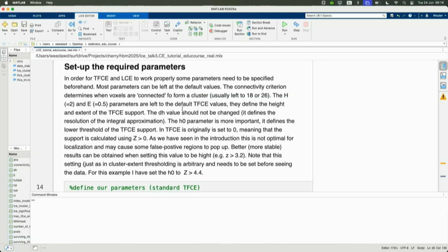So you can tweak the analysis so that, for example, if you know that you have high small peaks, you can tweak the analysis a bit to search for that in a way. So you can treat that.